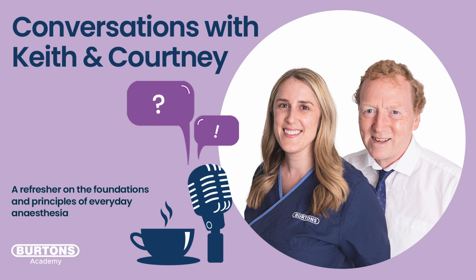If you think about what 1 to 1 means, it means that inspiration and expiration are exactly the same time. So there's no time for a pause at the end of expiration. Now, if the animal can't, for whatever reason, due to airway resistance or whatever, breathe out in that 1 second, then you're actually going to start inspiration before expiration has ended. So you'll get a phenomenon called breath stacking, where you start to pump the patient's chest up. Because it doesn't quite fully expire, you give a full volume, and you start to get breath stacking, and then you'll see your pressures just going to go higher and higher and higher.